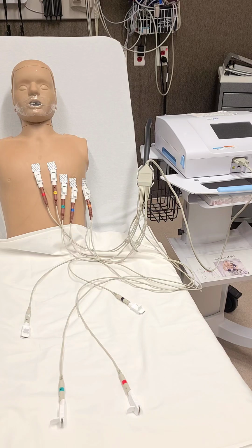Ensure the patient is comfortable and relaxed, and place them in a supine position if they can tolerate it. For women, breast tissue and implants can affect the electrode placement, requiring some adjustments to ensure accurate readings. And lastly, remove cell phones away, as these devices can also produce interferences with the readings.